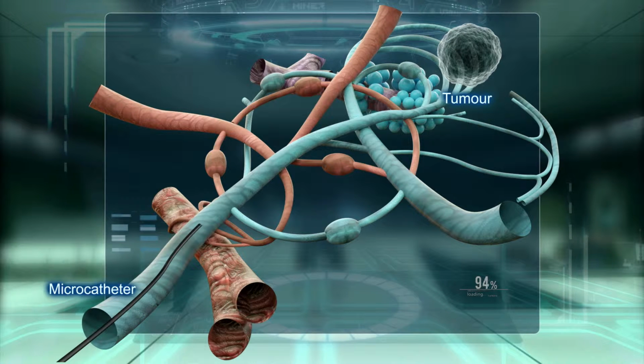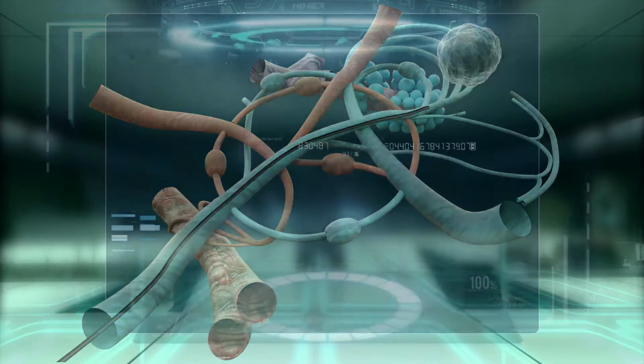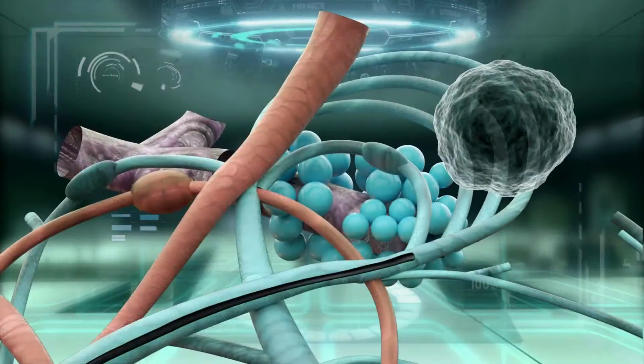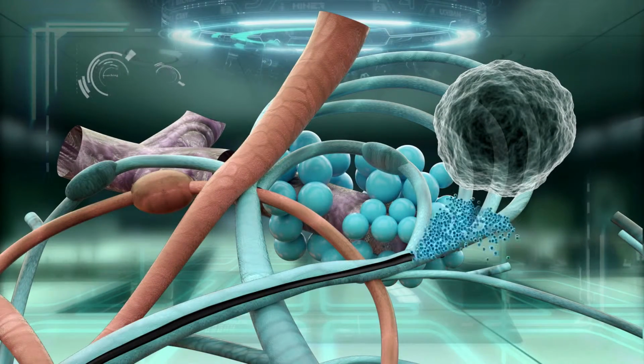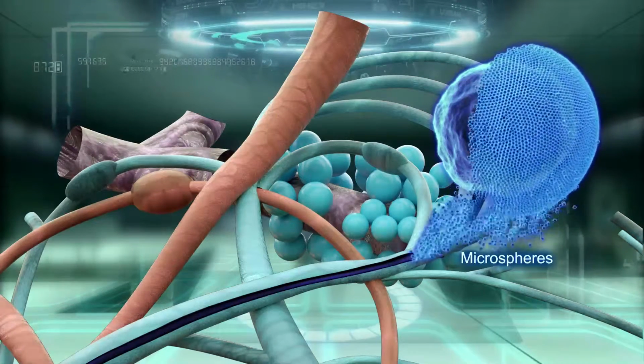The embolization with eluting beads through the pulmonary arteries aims at reducing the heat sink effect around the tumor. The vascular factor is eliminated by the embolization of the whole segment containing the tumor.